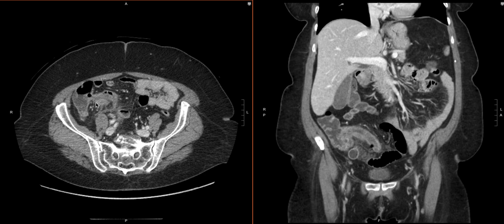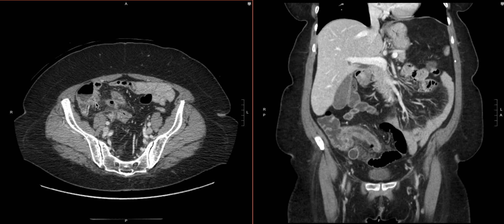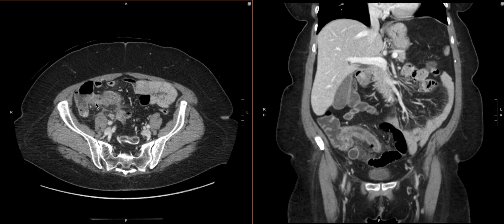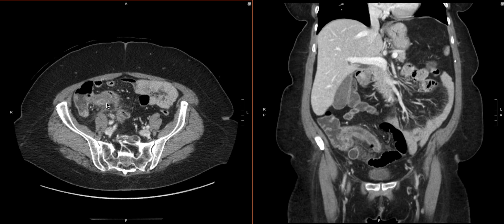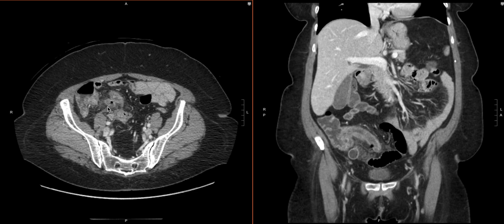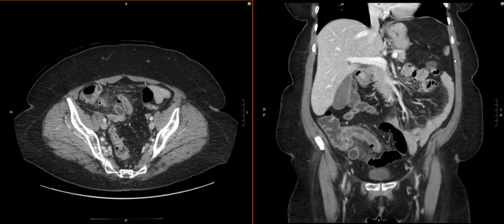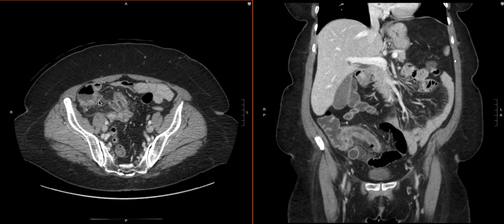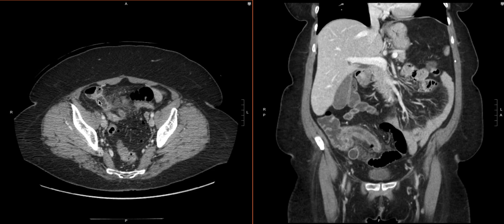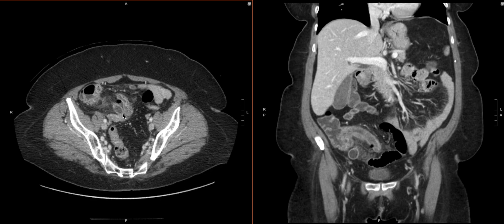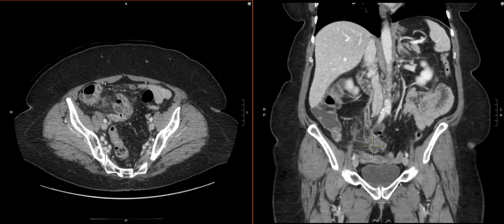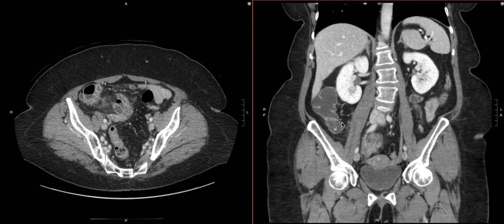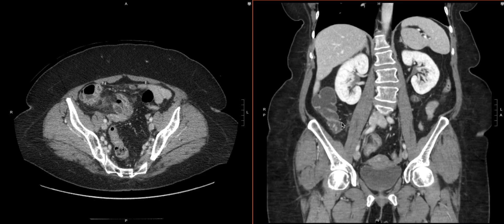Now that we know it's the appendix, we do see that it's inflamed. There's some adjacent fat stranding and maybe some hyperemia. We have to follow the appendix all the way to the tip — and we see the tip here, so it is blind-ending.